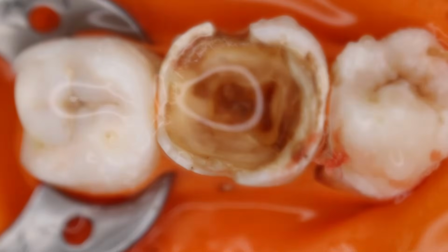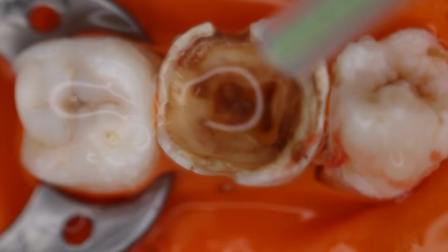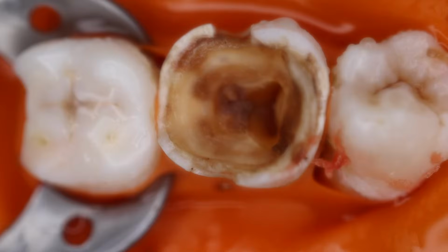So now you can see that we have started to remove the caries initially. The first thing that we are doing is removing the caries. We are not just identifying the orifices, we are going to remove all the caries that is there.